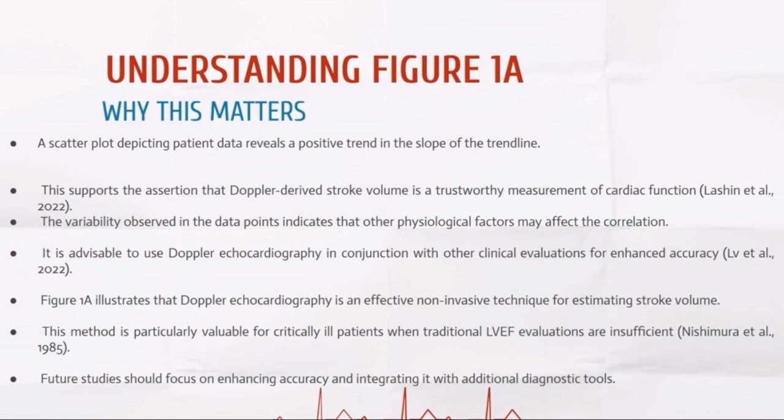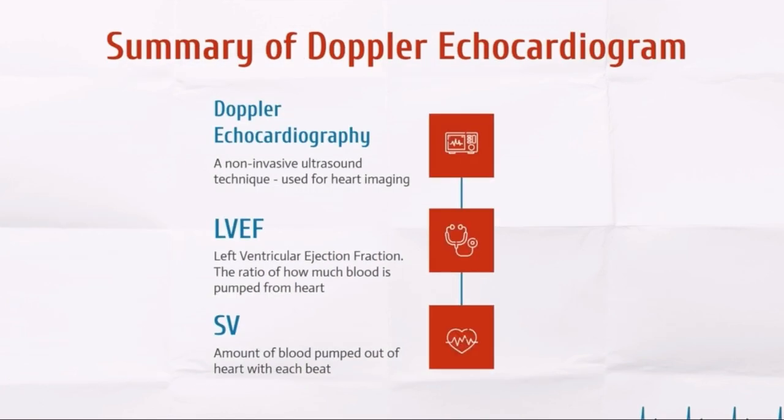This method is particularly beneficial in situations where conventional LVEF evaluations may be restricted due to the patient's state or difficulties in imaging. To summarize what has been discussed today, the Doppler echocardiography is a 2-dimensional ultrasound imaging technique of the ventricular area of the heart. This has been a useful technique in the medical industry as it is widely available and an easily accessible tool. As well, it is non-invasive, so does not require major surgery. However, when used alone, it is susceptible to misdiagnosing and mistreating heart conditions.